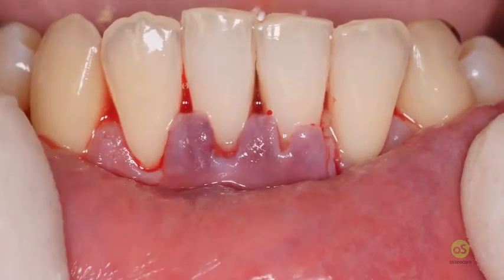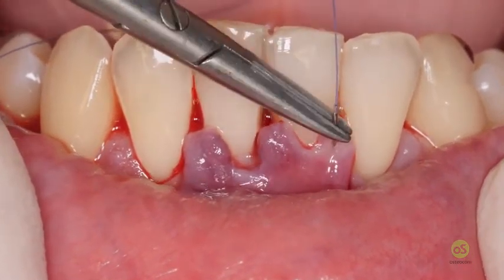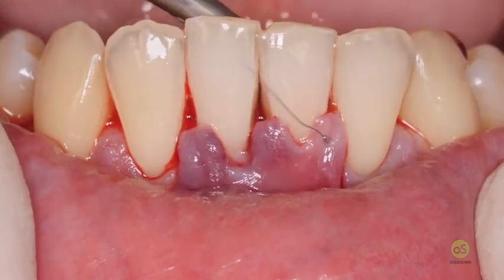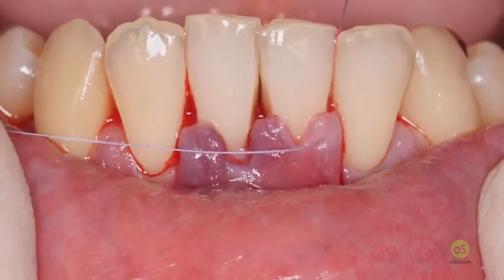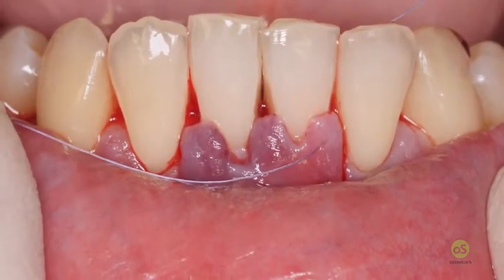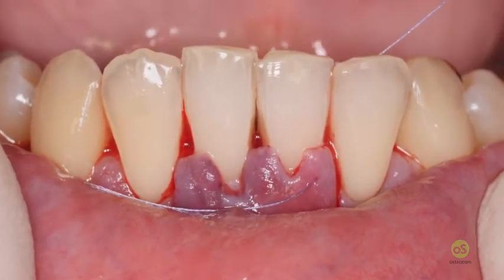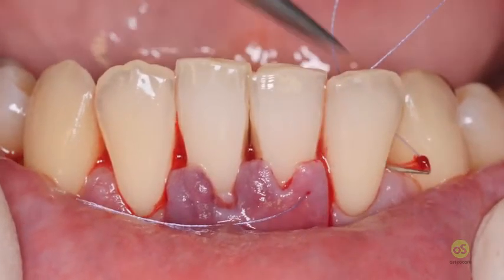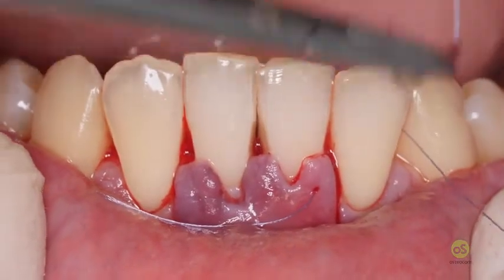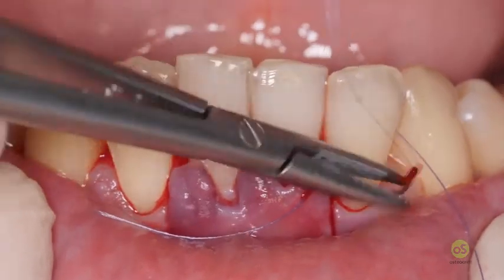So I will make the same sling suture I did before: surgical papilla, perforation, anatomical papilla. I will take anchorage to the distal papilla because I don't want to perforate the weakest papilla, that is the one in the middle. And this is called a positioning suture. It's a suture that will allow me to position the papilla in the final position so that I will be able to close the vertical release incision.